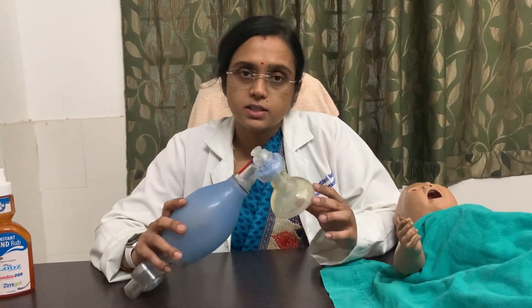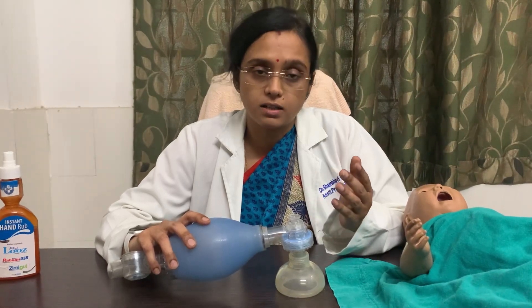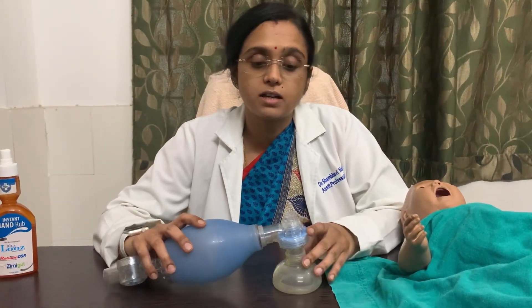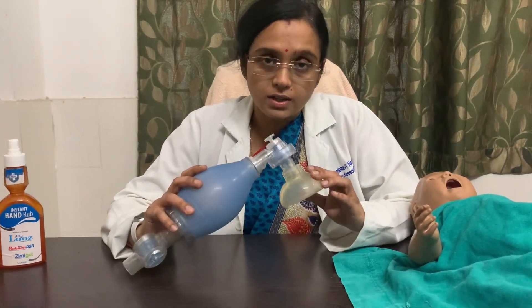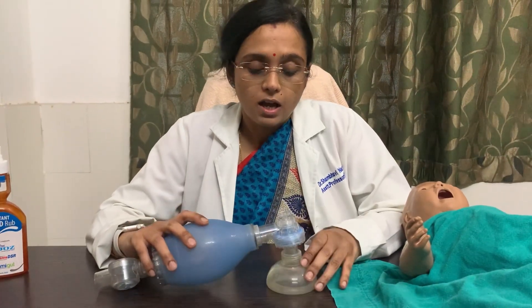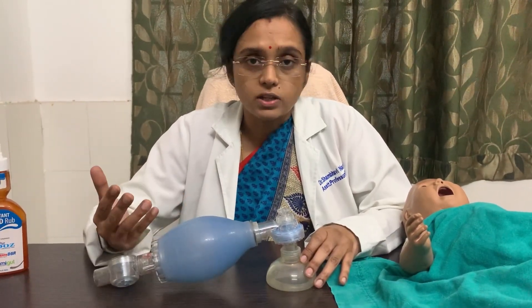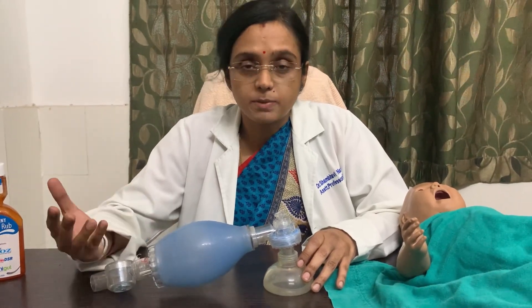We use it in neonatal resuscitation immediately after birth if the baby is in apnea, gasping, or heart rate is less than 100 per minute. Also, if you find any patient who is in apnea, gasping, or in impending respiratory failure, you have to use the self-inflating bag according to the size of the patient to give positive pressure ventilation. If you are planning to electively intubate a patient, you also need to keep it handy.